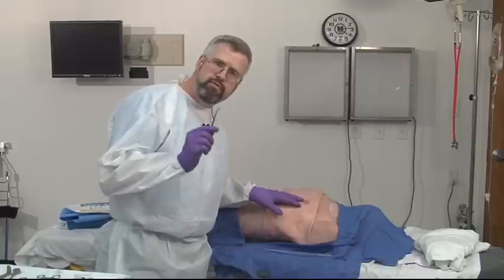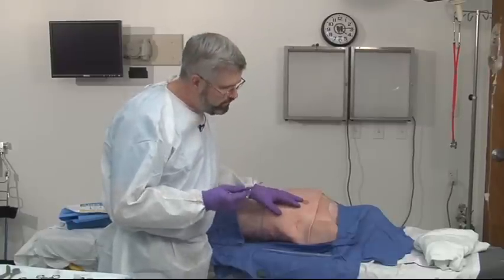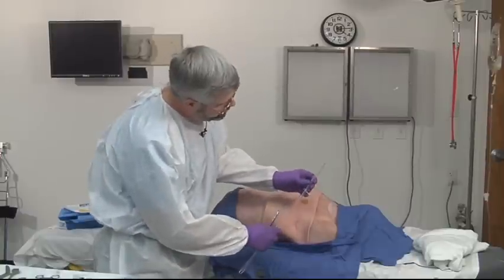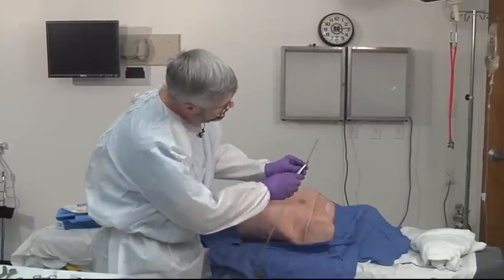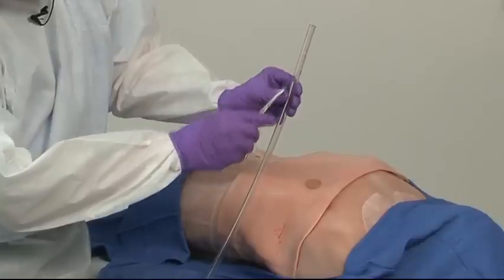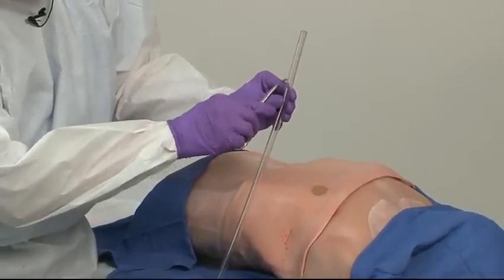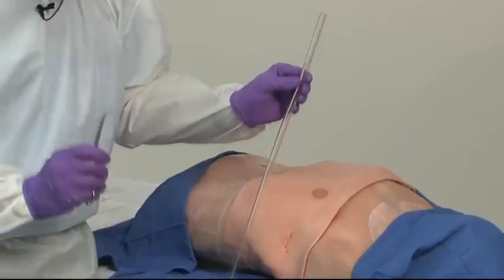Because we're suspecting in trauma that there's blood, we always want to use a fairly large tube, at least a 36 French tube. And if you look at the chest tube, it has several holes in the end of it, and that last hole breaks this white line. This white line shows up on an x-ray, so if you look at an x-ray, you can tell where that last hole is in relationship to the skin.